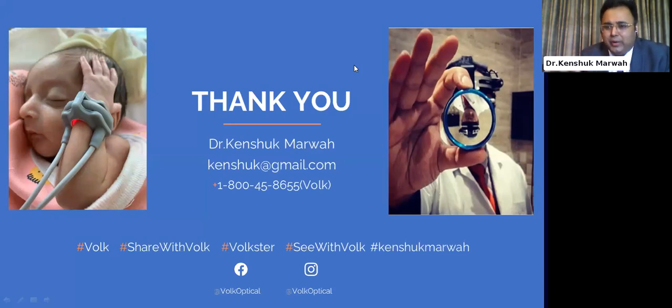You have to do it to believe it. It is something like that. So I use a digital mag lens, which is like a 66 diopter lens. I compared both of them, and the digital lenses actually give you less glare. So you have to look at what you are observing.